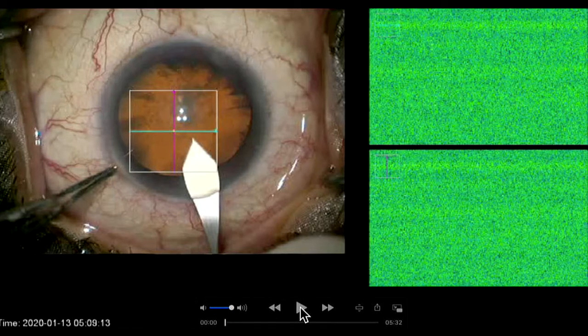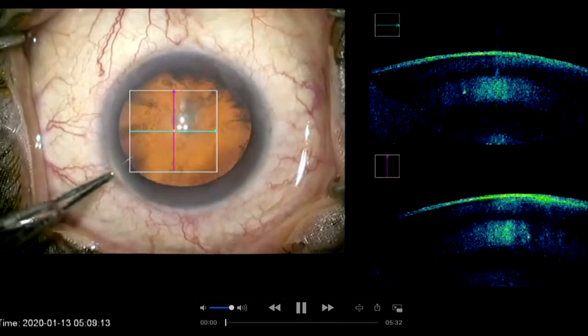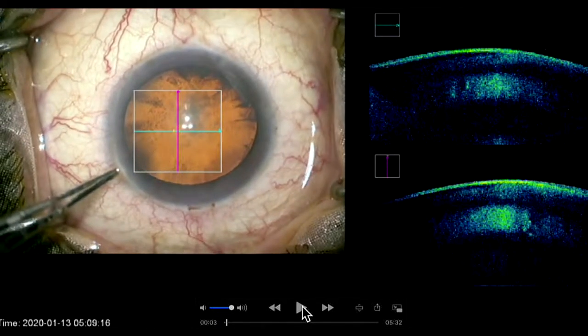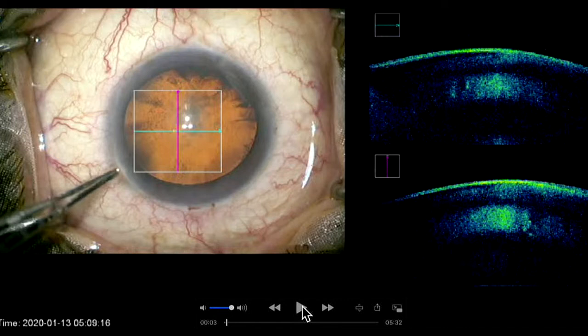You can see this is a patient who has good dilatation. Dilatation is very, very important, and examination of the eye as such is important — right from the cornea. The ocular surface should be pretty good for these patients. If patients have ocular surface disease, that has to be treated before surgery. If you are looking for multifocal or toric lenses, your topography can be totally changed with or without treatment of the ocular surface. So look for ocular surface disease, especially meibomian gland dysfunction, in this age group of cataract patients.